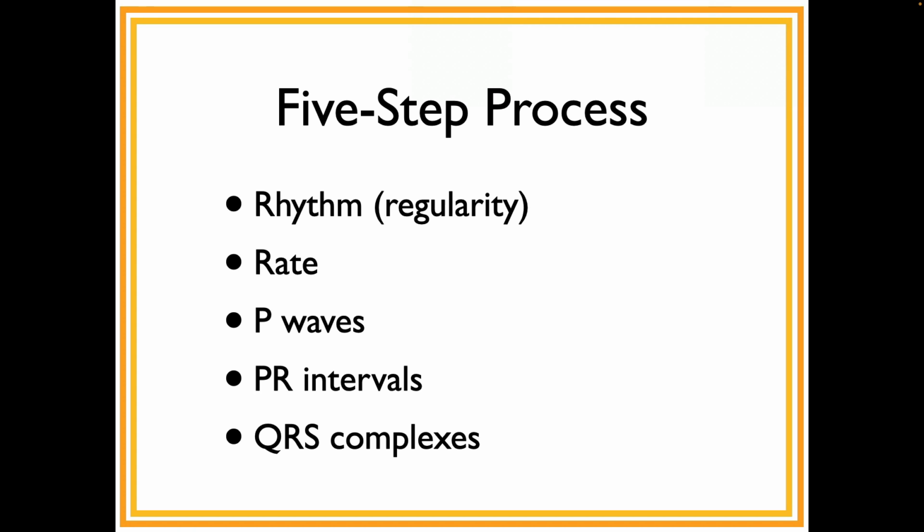And the closer you are to the beginning of learning about ECGs, the more frequently you're going to bump into strips that you have no idea what they are. So you need to really memorize this process. So what is this famous process?